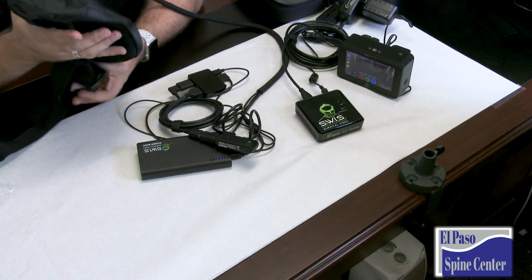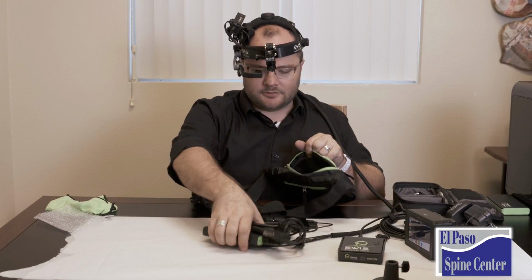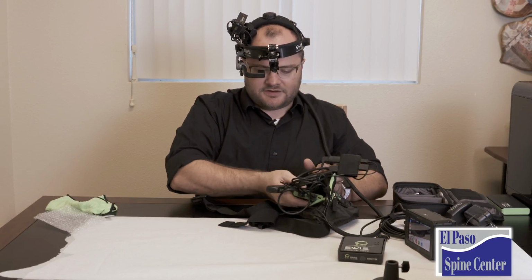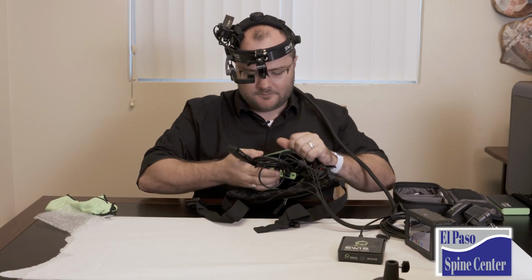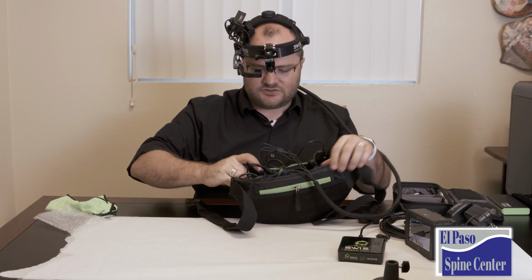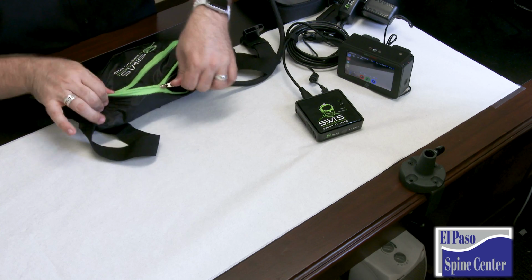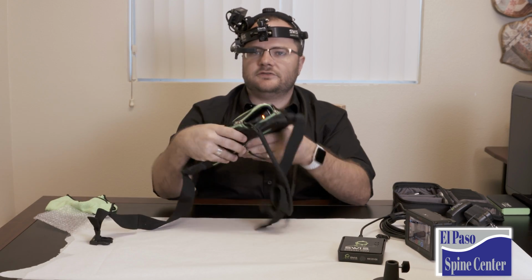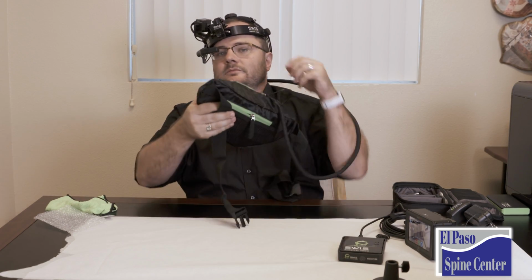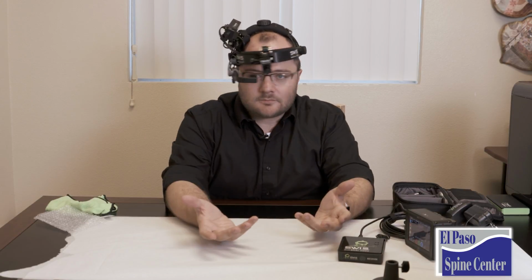And remember our swanky bag that we had earlier? All I'm going to do is take this entire setup, which is partly why I want the smaller HDMI. The wireless, the battery supply, the HDMI splitter, they all fit right in here. I can zip this up. This goes on around the waist. This cable goes around the back, and I have a complete system. Kind of. It's completely wireless.